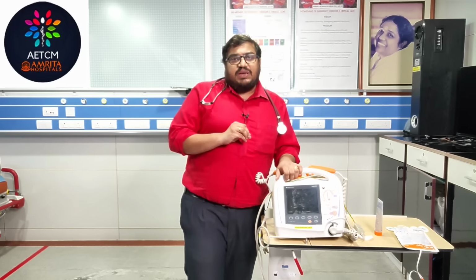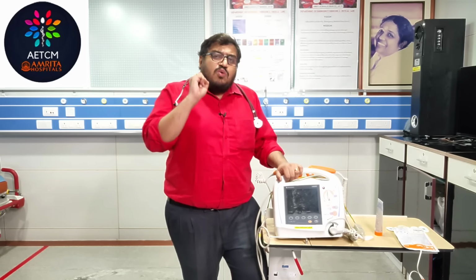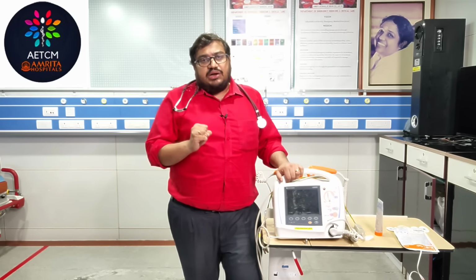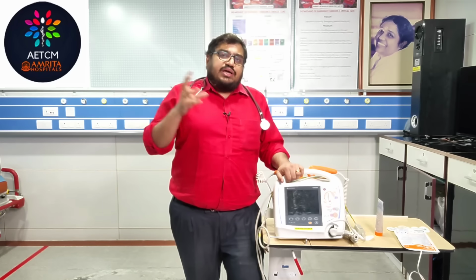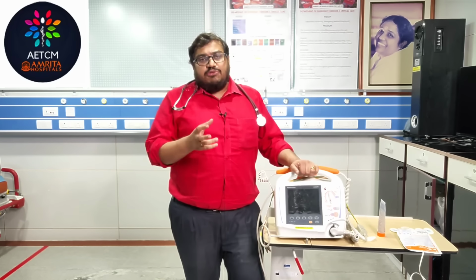Now defibrillators are basically used for two purposes: one is defibrillation and the other is cardioversion. As the word implies, defibrillation means you have to defibrillate the heart by providing an external energy. In cardioversion, you are converting the rhythm of the heart by providing an external energy. So that is the difference between defibrillation and cardioversion.